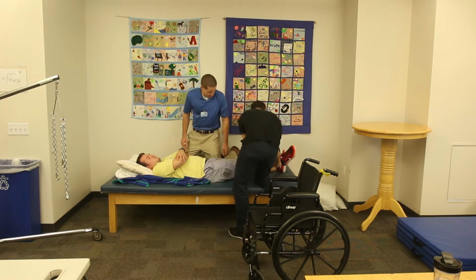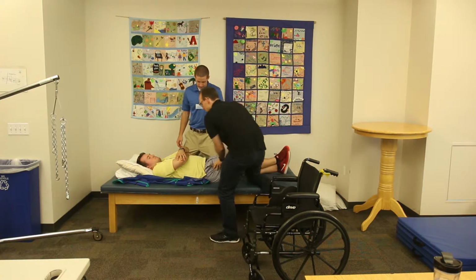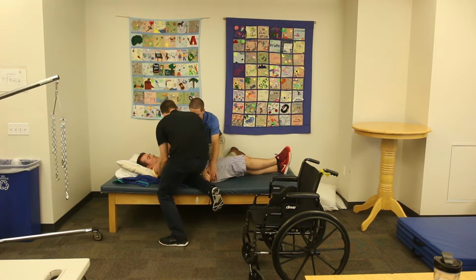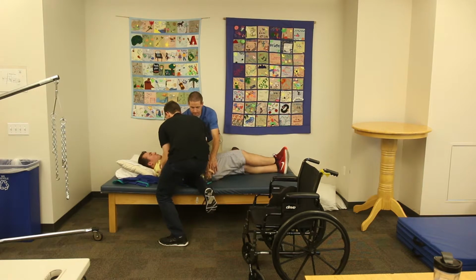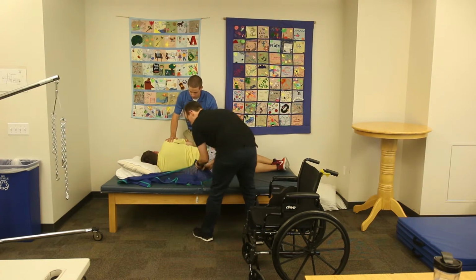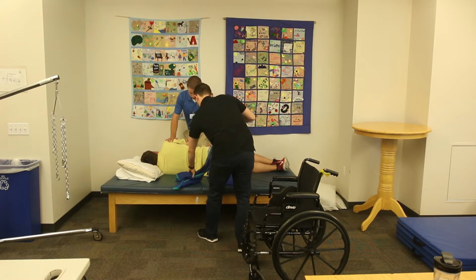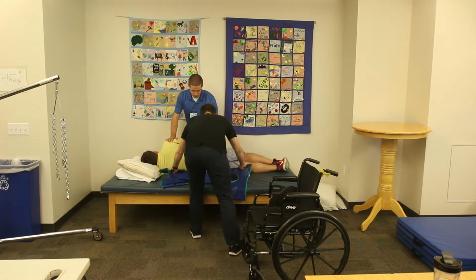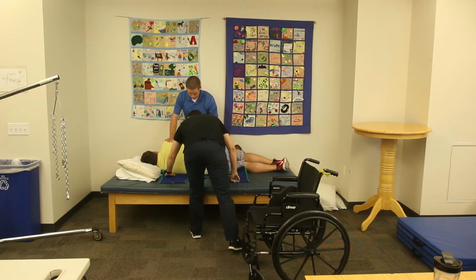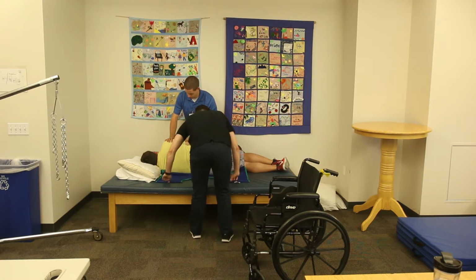So Richard, we're gonna roll you to your other side. We'll do it on a count of 3, and I want you to help out as much as you can, okay? Ready? 1, 2, 3. You got him, Dylan? Yep. All right. I'm gonna tuck this in. Kind of have to roll it, just so everything fits all right. Doing good, Richard? Yeah. All right.